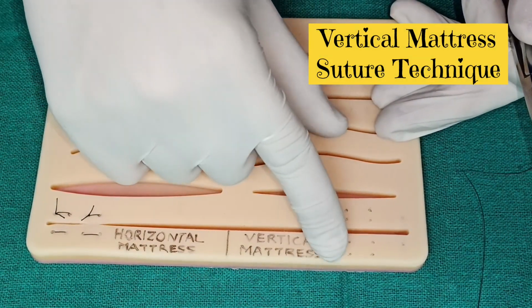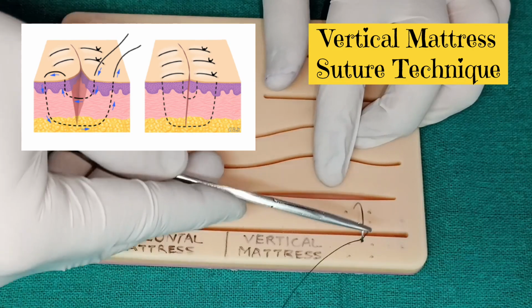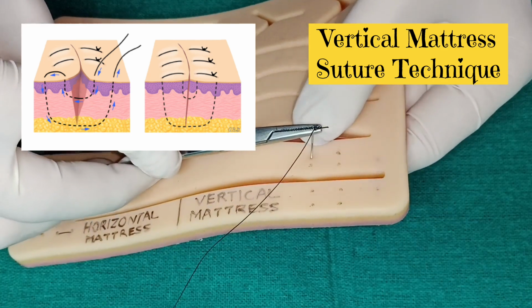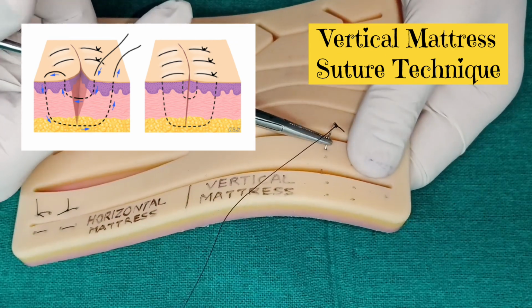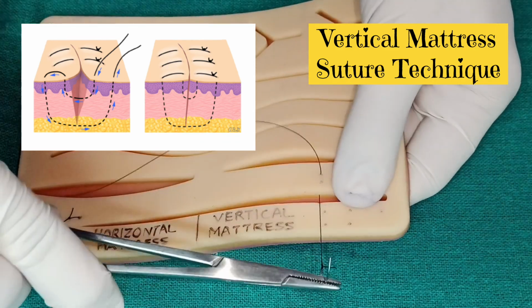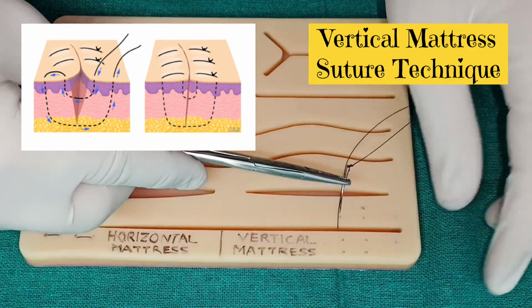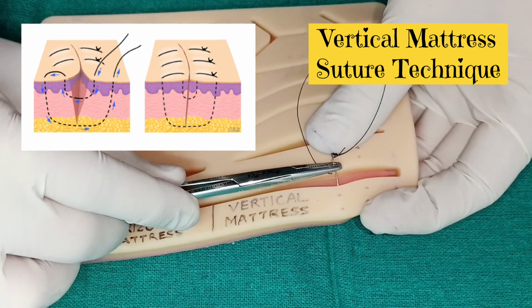This stitch is placed in a far near order of bites. So first of all we will place the far loop, as you can see in this video. The far loop enters and exits the skin surface at a 90-degree angle, some 4 to 8 mm from the wound margin. This loop passes relatively deep into the dermis.